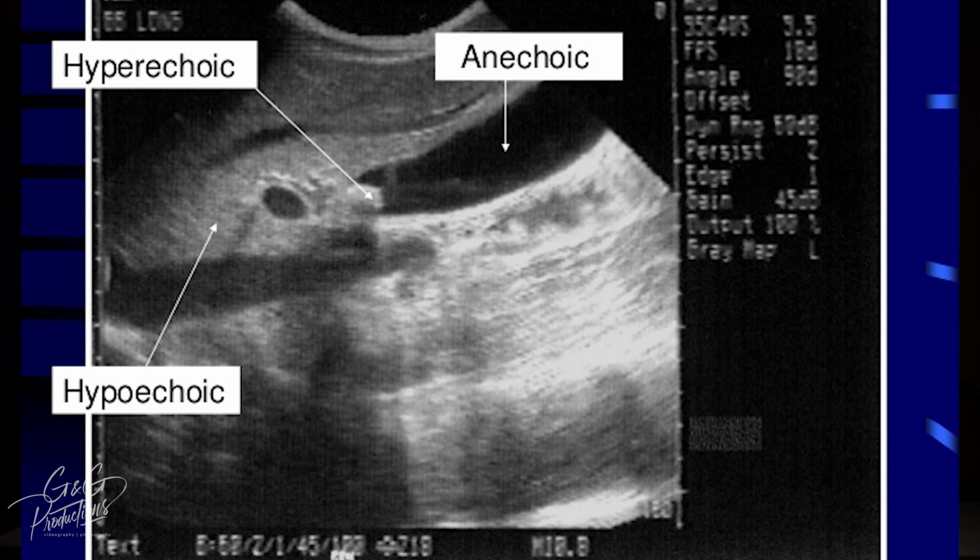But we'll get into that later when we do several other types of exams. For now, let's just stick with the cardiac exams, right? Okay, so echogenicity, hyperechoic, hypoechoic, you're now well versed in how the ultrasound terms are used. So let's begin with how to get a good image, right? There's 4 tips in getting a good image. The first of them is gel.